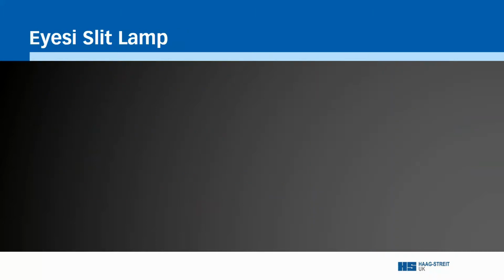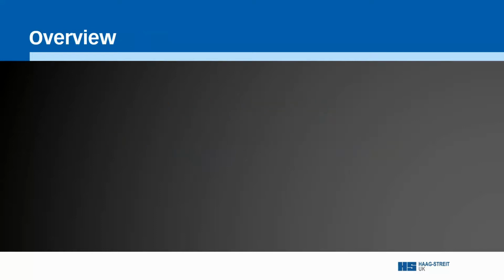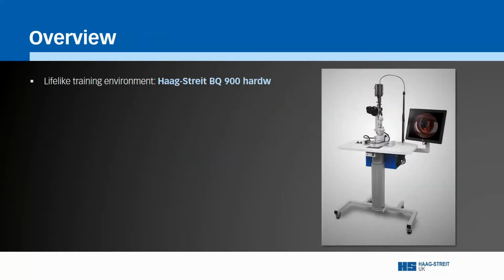That's why the Eyesi Slit Lamp Simulator is such an exciting development, providing an incredibly versatile training environment to learn the skills needed for all types of slit lamp examination. The Eyesi simulator offers a familiar and lifelike training experience as it's based on the Haag-Streit BQ900 slit lamp, one of our most popular models.